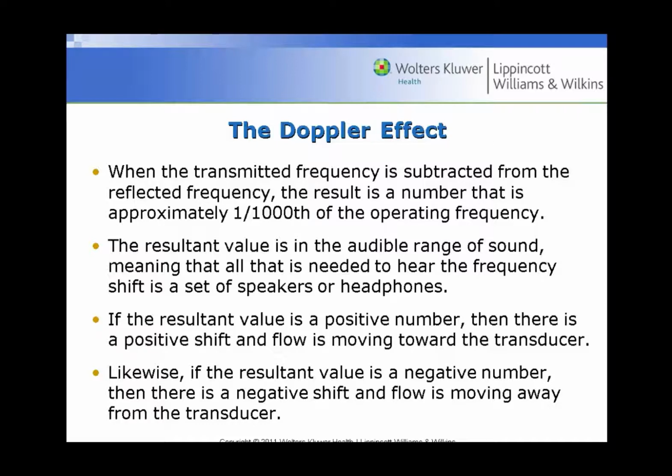So one of the things that we'll want you to do is to really get used to hearing what these sounds concerning pathology are going to sound like. Of course, you know that if we have a positive Doppler shift, it's going to be a higher pitch. If it is a negative Doppler shift, then it's going to be a lower pitch. And that will also tell you if it's moving towards or away. And then we know the assignment is blue is away and red is towards.